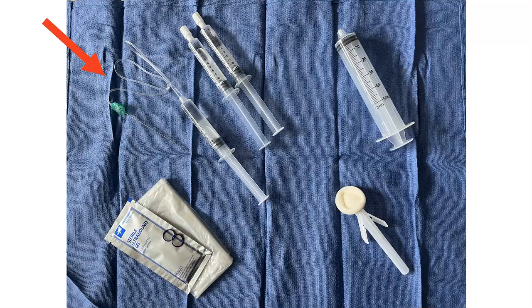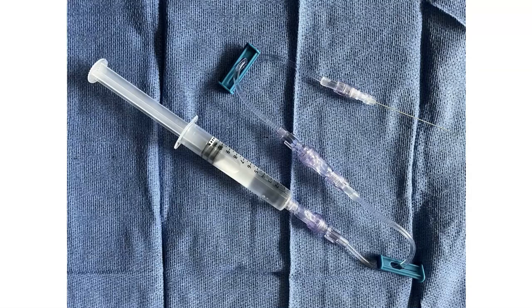This slide shows the equipment you'll need for the procedure. Shown here is one of the echogenic needles that we have in the department with extension tubing attached, flushed with saline syringes, some extra saline syringes, a 30 to 50 cc syringe for your medication, a chlorhexidine swab, and a sterile ultrasound probe cover. If you don't have access to the echogenic needle, you can create a similar device using a spinal needle connected to two or more sets of IV extension tubing, again flushed with saline.